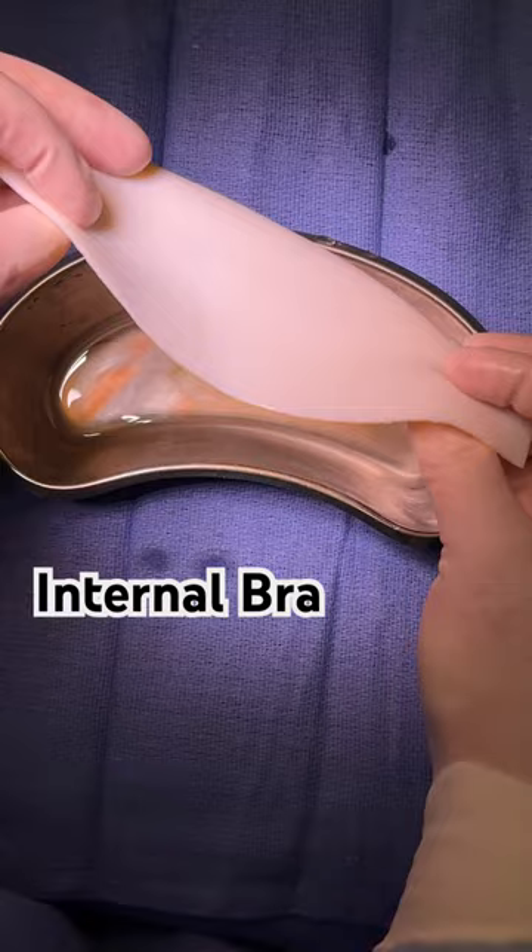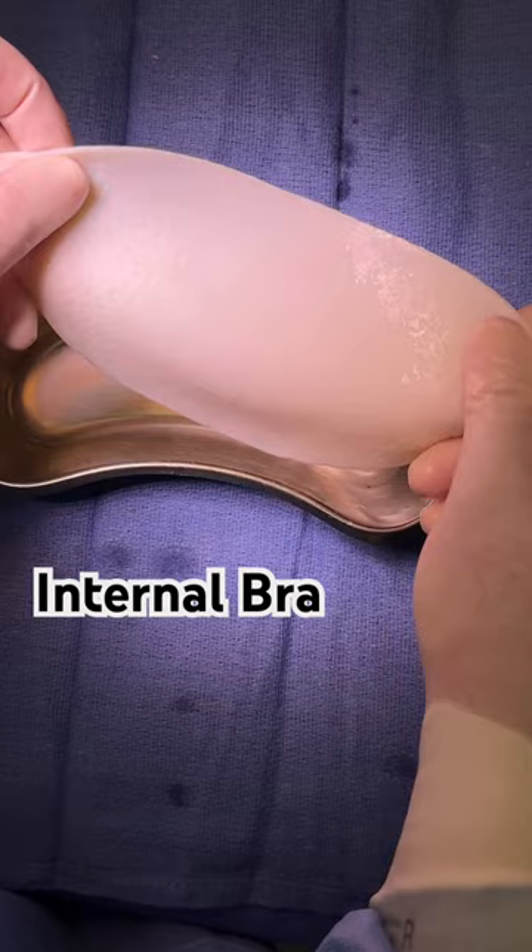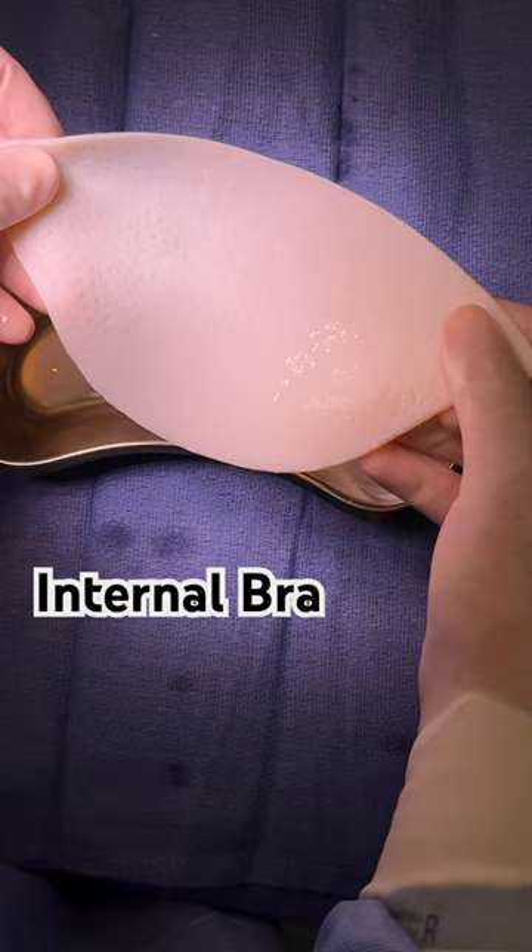The reason we're using it today is because it's better to prevent recurrent capsular contracture. This woman has had capsular contracture in the past, and we're using this to not only support the lower pole of the breast, but also to decrease the risk of recurrent contracture. You can see it's shaped to contour to the lower part of the breast, and then our implant's going to sit and be supported by this. Great product.